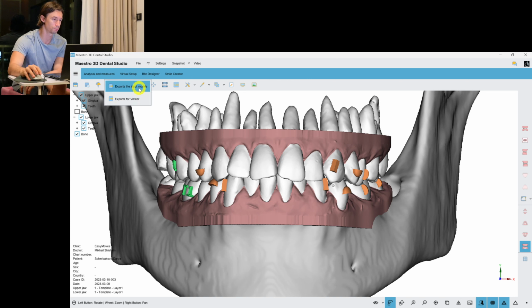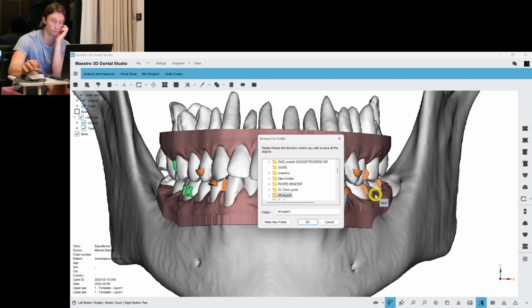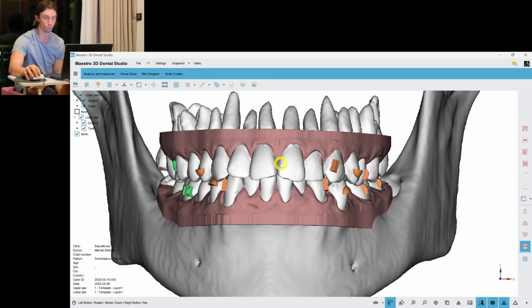First of all, I export the setup from Maestro. If something happens, I always save all the setups so that I can open them on any other PC. And if something happens, if my computer breaks, I don't know, if I spill water on it, I don't lose my database. It's super important. And then I upload this case to the web viewer.